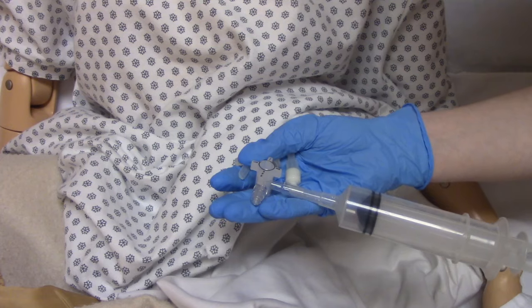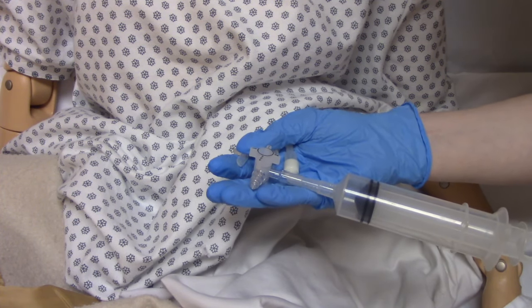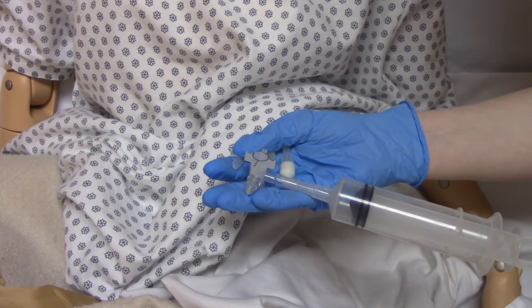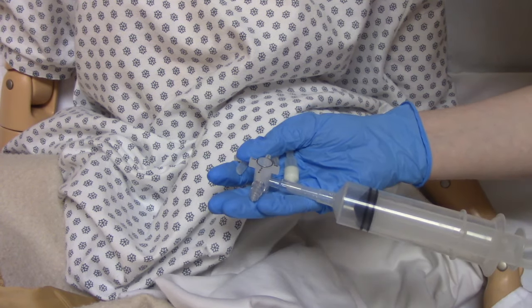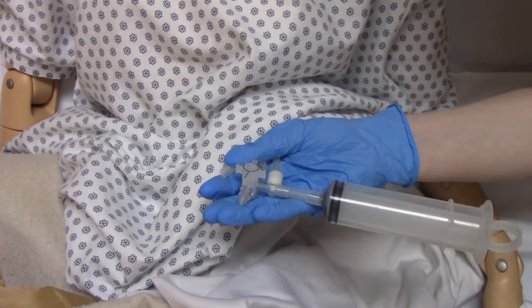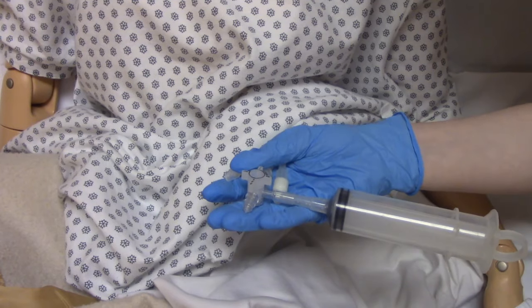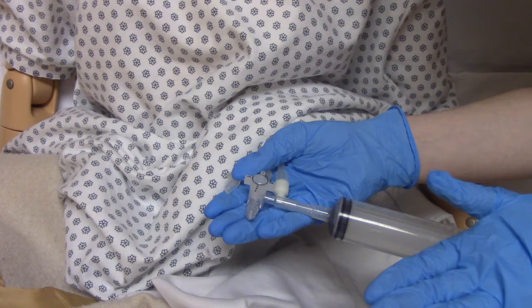Every hospital will have its own policy on what to do with the gastric contents you pull back. Some will say dispose of it in a biohazard bag; others will say push it back in and return it to the patient since it's their own gastric contents. That will vary hospital to hospital.